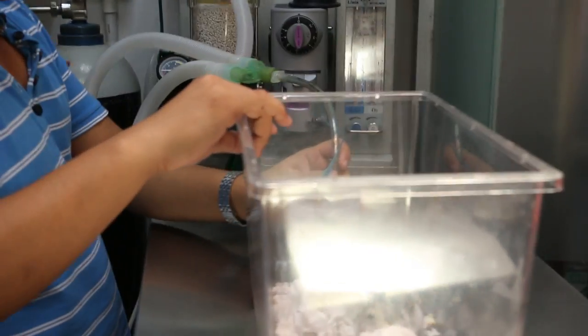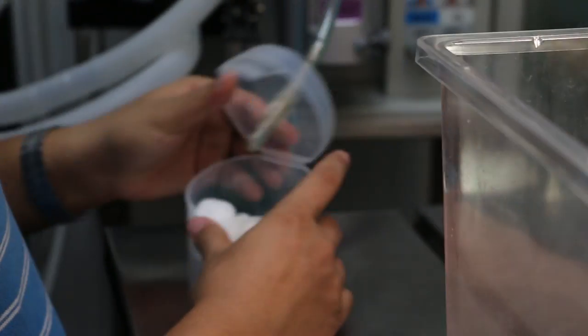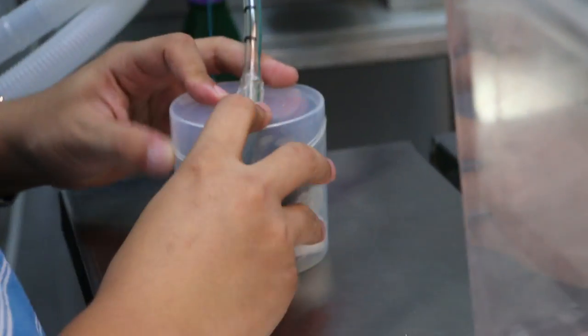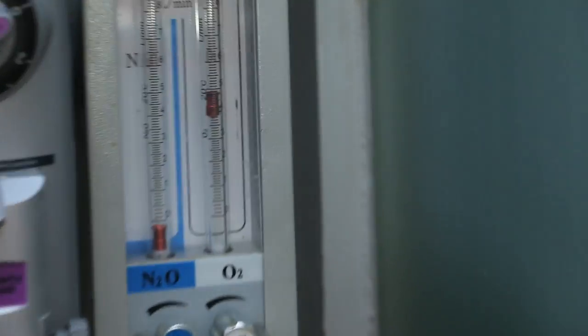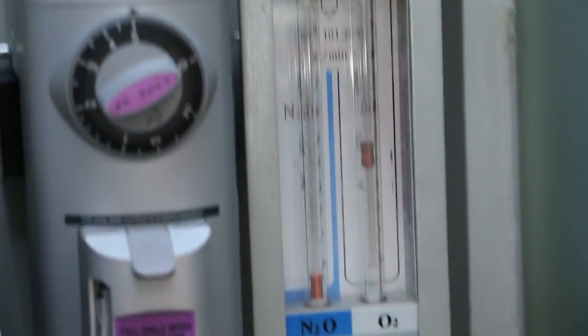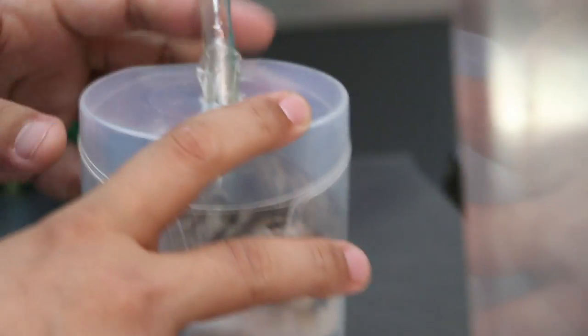Now, the Zoletil is given minimum because of safety, to be safe. And this hamster is quite big, yeah. So one drop might not be sufficient. We use a gas, high flow rate, oxygen, isoflurane at 5%, and start at 4:15. So we'll put the side on.